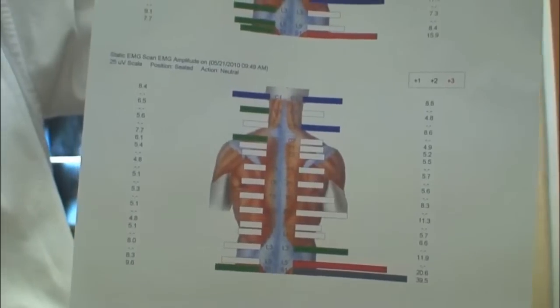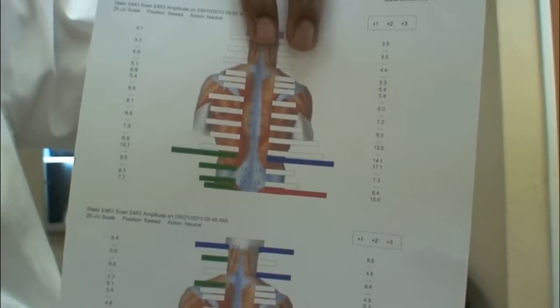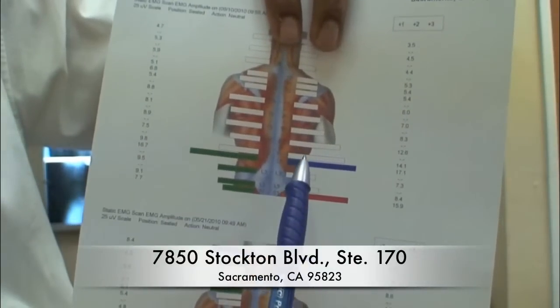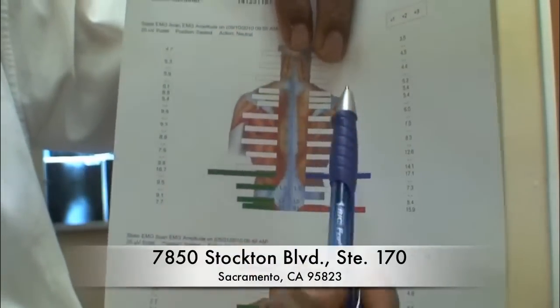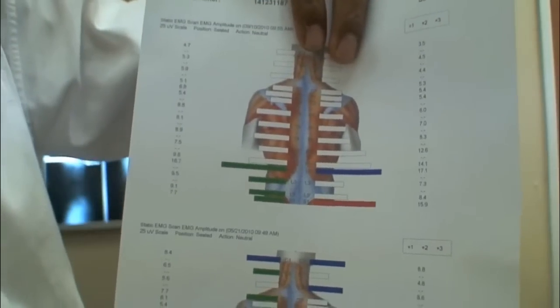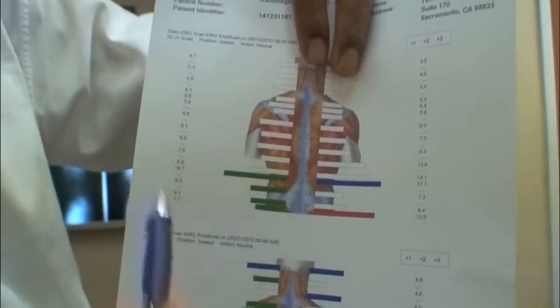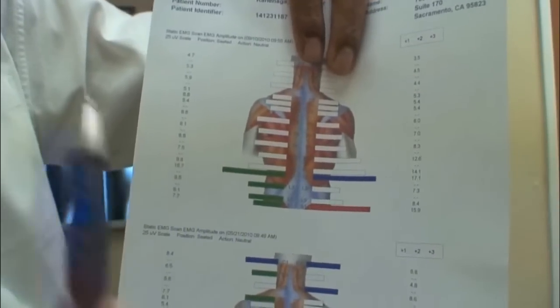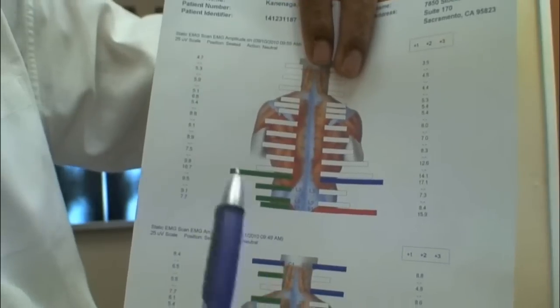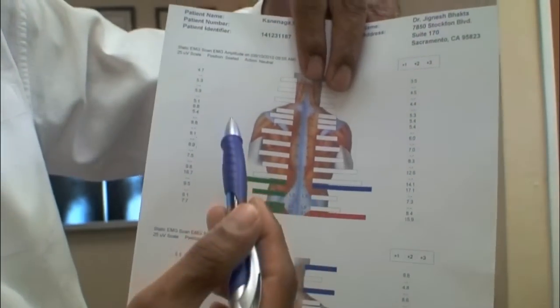Now, this is the new one, and if we look at that, there's a little bit of signal still here. There's a red mark here and a blue mark here, but the rest of the area is all cleared up and the black mark is gone. Also, Chris is doing fantastic symptom-wise. Somewhere down the road this will progress as well. Chris does have a condition called spondylolisthesis, but with all of his other conditions too, he's still improving and progressing.